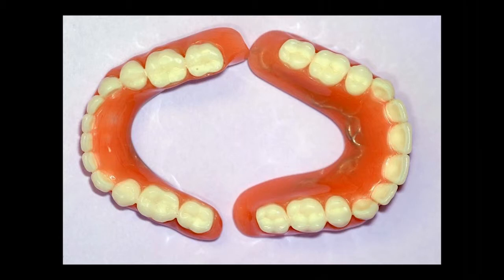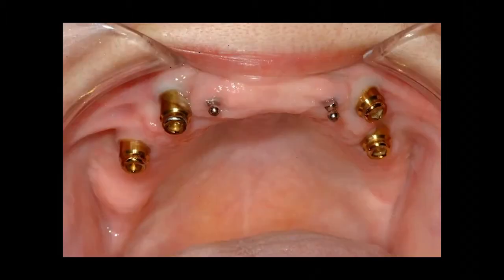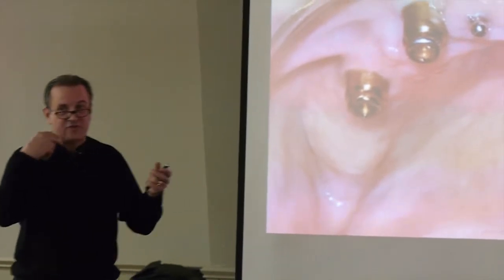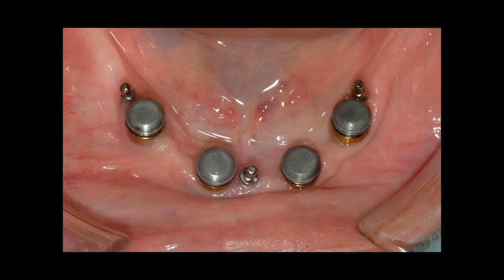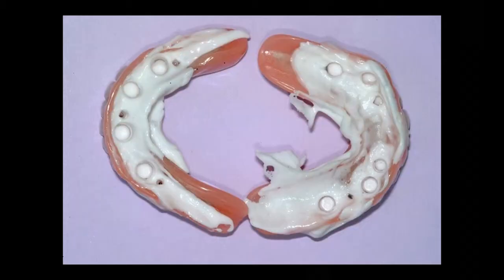But here you can see the metal reinforcement inside of her upper. You can almost see it inside of the lower. These things wind up staying. So not only were we curing in our locator attachments, we also had to include the O-rings. So the same thing up here. This case has been in a long time. This is what I want you to watch for: see that silver? When they start showing that, what you're going to find is your retention starts dropping off. And I don't know how to stop that. But here you can see the housings are sandblasted. So when we go to cure these things in, the acrylic is going to stick much better to that sandblasted surface.